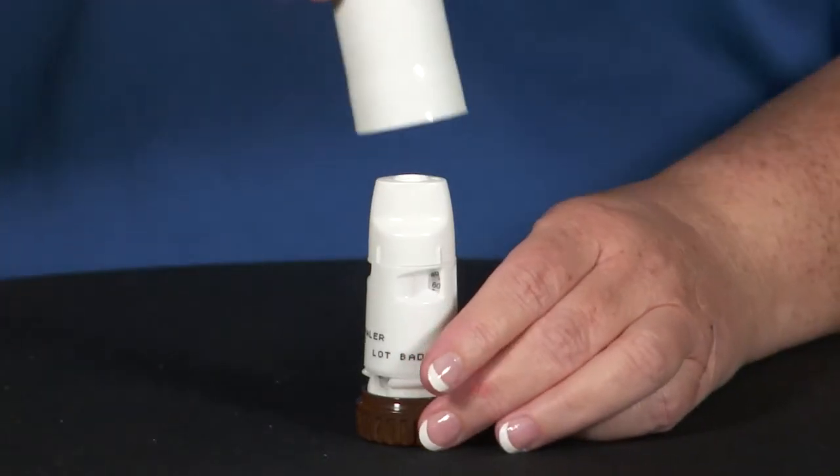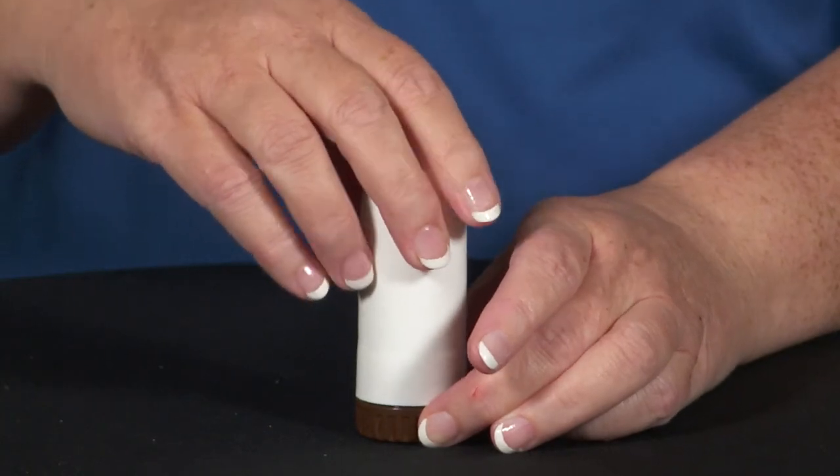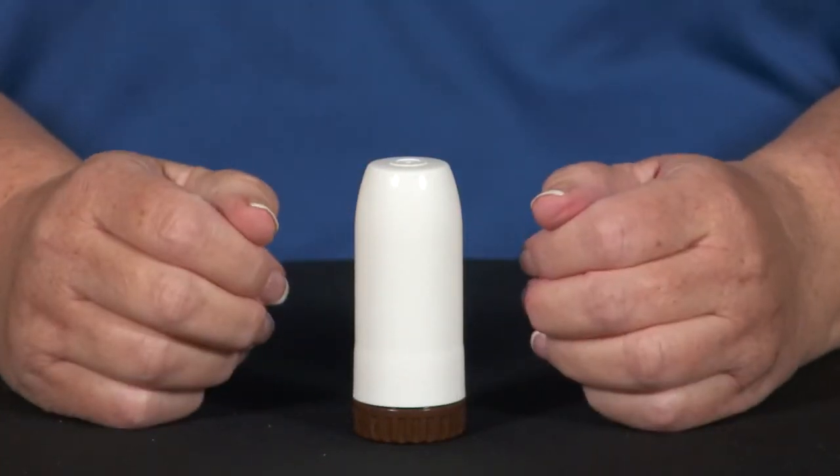Close the inhaler by twisting the cap clockwise to the right as you gently press the cap down over the mouthpiece. Because the Flexhaler contains an inhaled corticosteroid, after inhaling the prescribed doses, rinse your mouth, gargle, and spit. Do not swallow to reduce the risk of a fungal infection in the mouth called thrush.